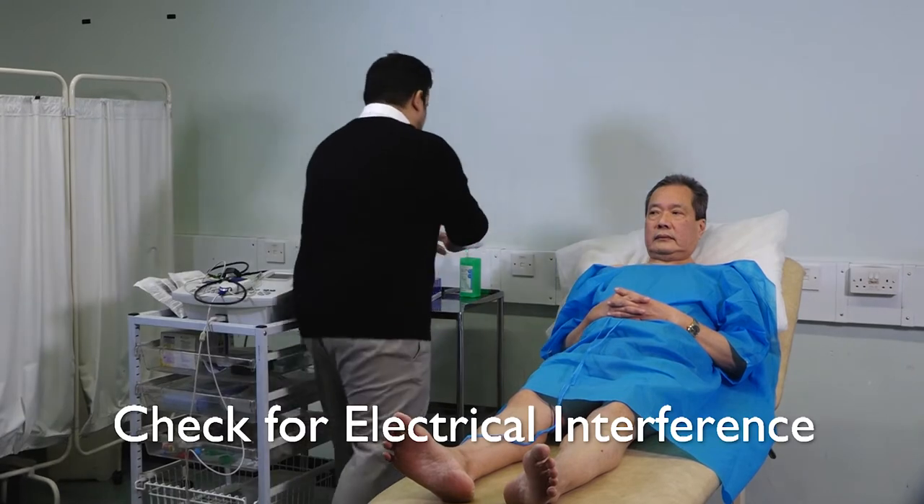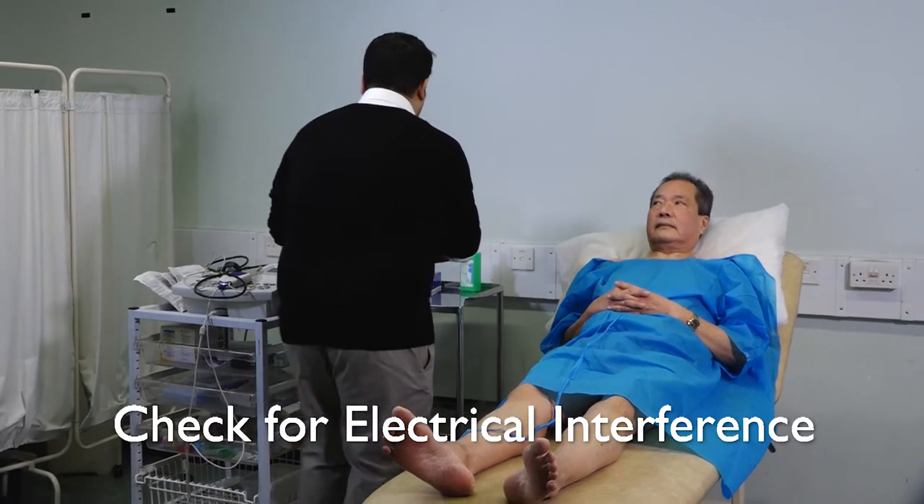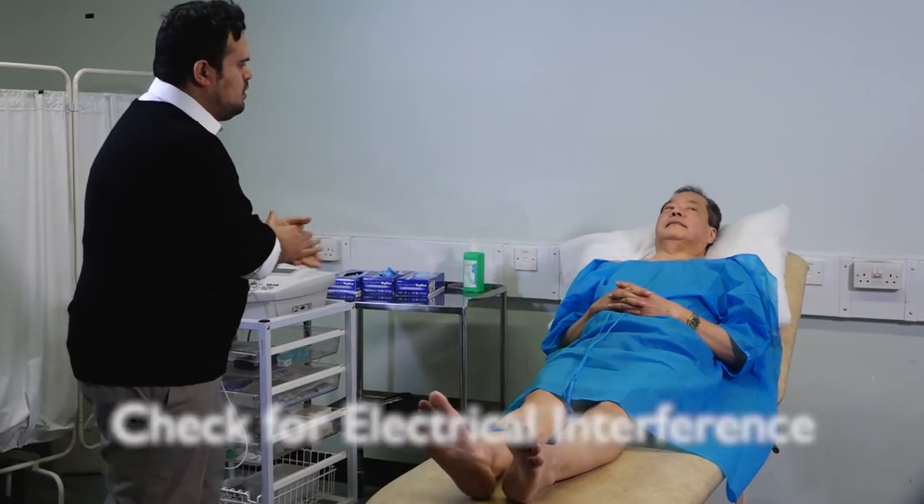Check for any large pieces of electrical equipment that may interfere with the ECG recording.